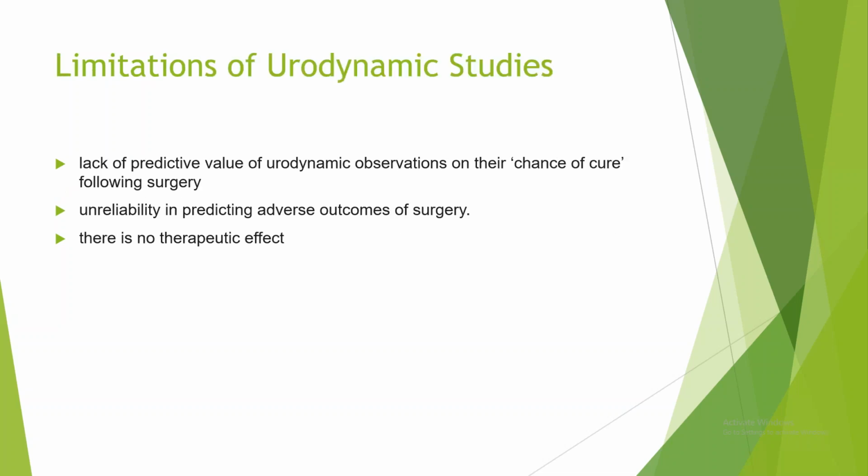Because it does not give you a guarantee of the chance of cure, they are not going to tell the percentage from the urodynamic study, in what percentage of patients the surgery might be curative. Also, it is unreliable in predicting the adverse outcomes of surgery. And as you all know, there is no therapeutic effect. It is a diagnostic test for that matter. So these are the limitations of urodynamics that the patient should be made aware of.